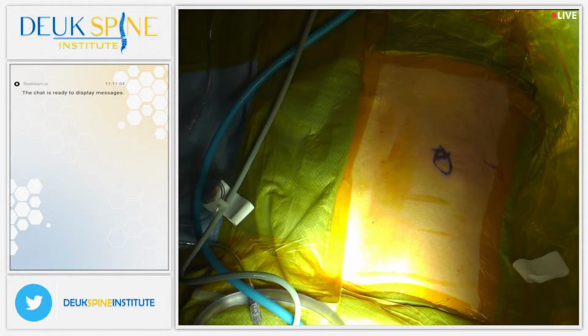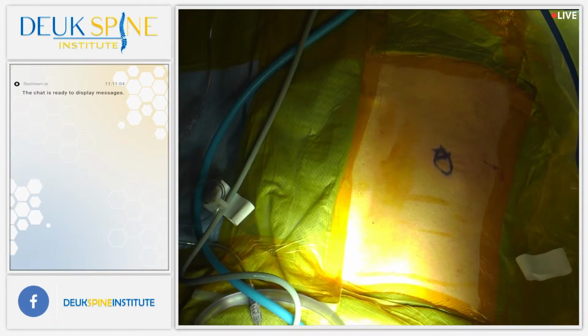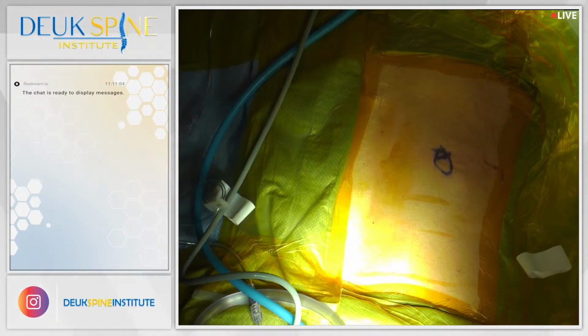Our first patient from today is doing better. She had complete paralysis of her foot. She's now moving her toe. And she says the pain in her back and down her leg is gone. She just has some soreness. So hopefully she'll make a recovery. This patient is our second case for the day. He's a left L4-5 Deuk laser disc repair.